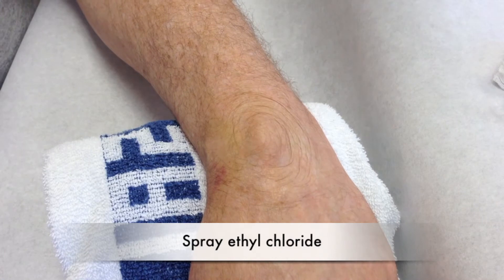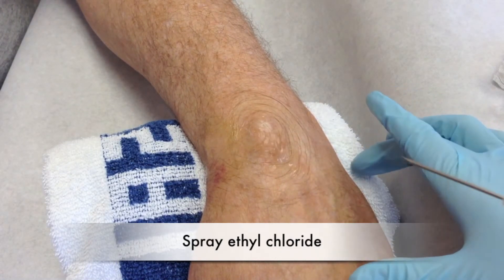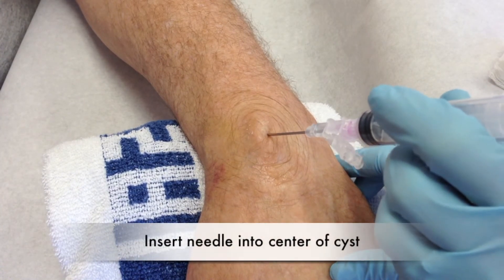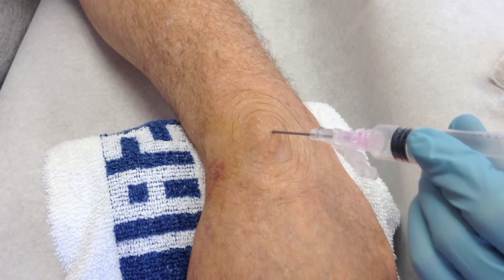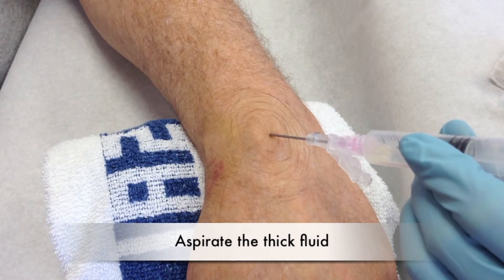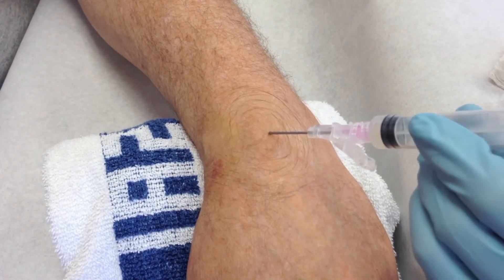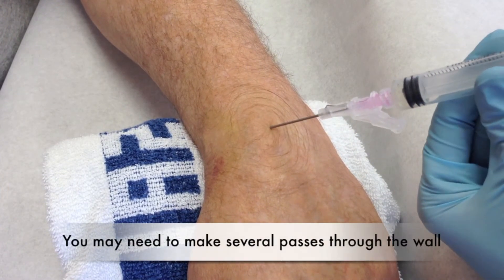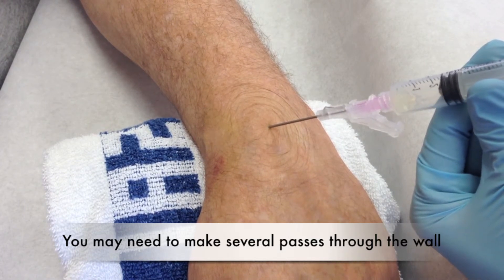To aspirate the cyst, spray ethyl chloride on the skin overlying the cyst until the skin turns white. Insert the 18 gauge needle quickly through the skin and into the center or belly of the cyst, then aspirate the thick jelly-like fluid. If the cyst is chronic and there are septations, you may need to pass through the cyst wall various times in order to get fluid from several compartments.